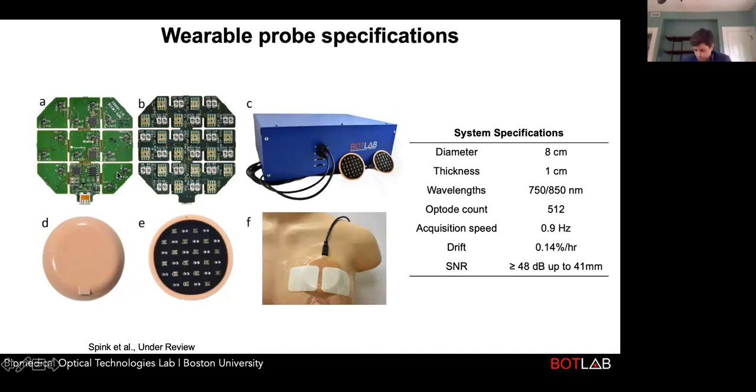Actually, yeah, I have one I keep. If you can see that, this can bend quite nicely and conform to tissue. And we encase this in medical grade silicone. We adhere it to the breast using Tegaderm tape. This is just IV tape.